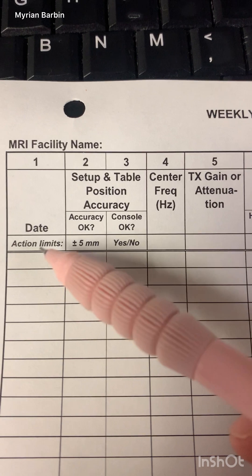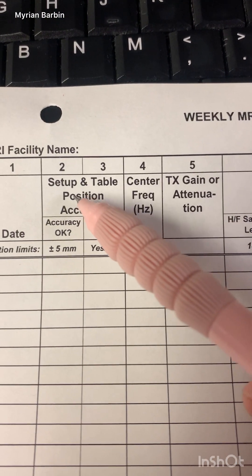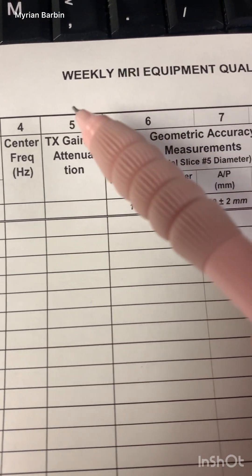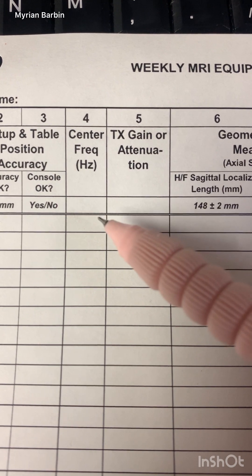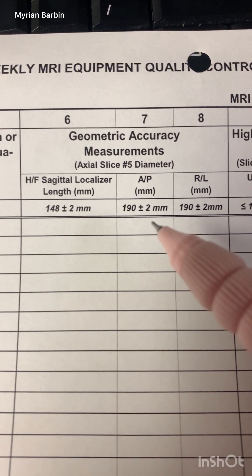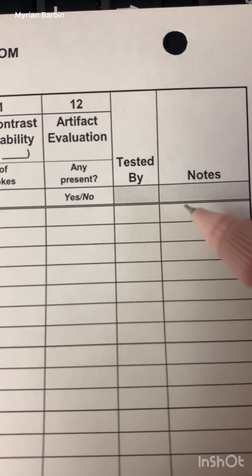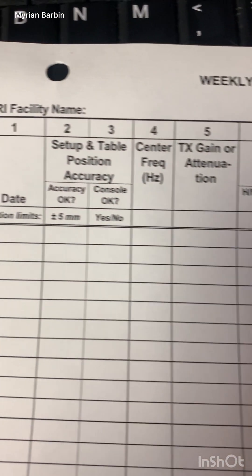This is how the QA form looks. Make sure you put your date and check that everything is accurate. You'll record your center of frequency, your gain, and information from the sagittal localizer. You also document your spokes artifact count, your initials, and any notes. This form is completed weekly.